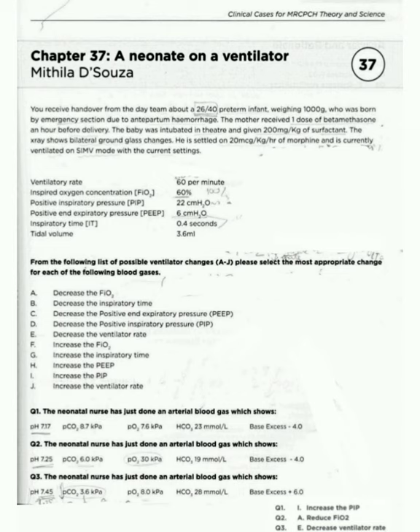So, only the partial pressure of oxygen is abnormal. According to the previous image, if the partial pressure of oxygen is low, then we increase the FiO2, and if the partial pressure of oxygen is increased, then we decrease the FiO2. Here the partial pressure of oxygen is 30, which is a huge increase. So, we decrease the FiO2. Reduce the FiO2 is the answer to the second question.